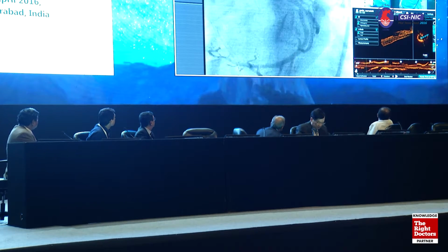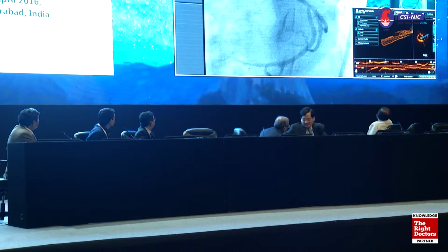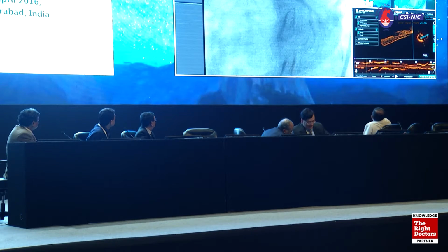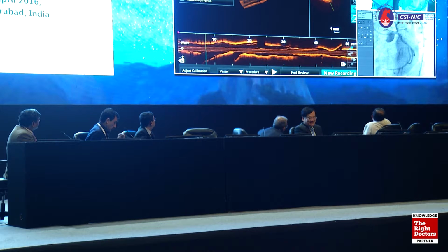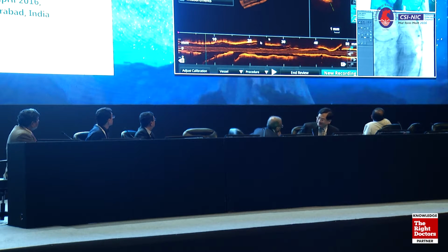Knowing that we started this case with OCT, we can bring the OCT to the main screen, just to show that the ostium is nicely expanded. Can you see the ostium of the side branch? You will always see slight plaque with the OCT, so don't get crazy about it.